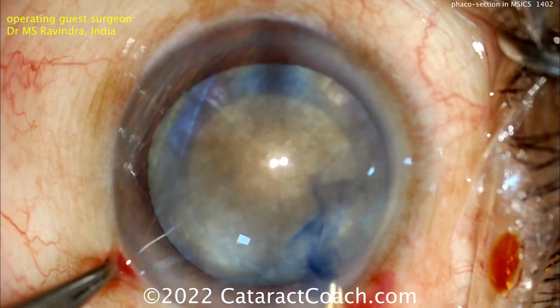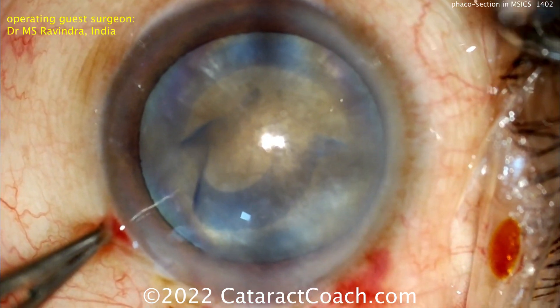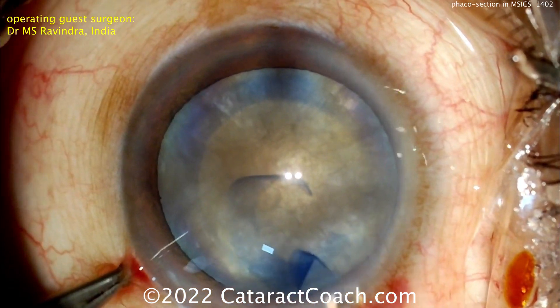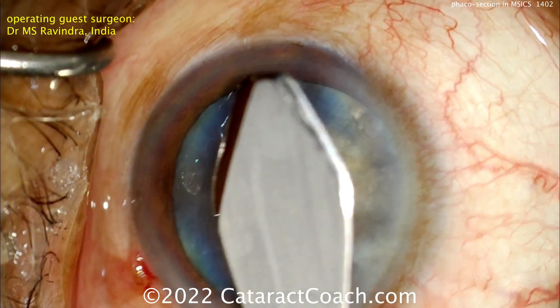This patient is actually going to get a multifocal lens. By making this incision on the steep axis — which is being done here — and in addition making the incision on the smaller side, you're able to control the astigmatic outcomes. This patient probably started off with perhaps 0.75 diopters of with-the-rule or against-the-rule astigmatism.